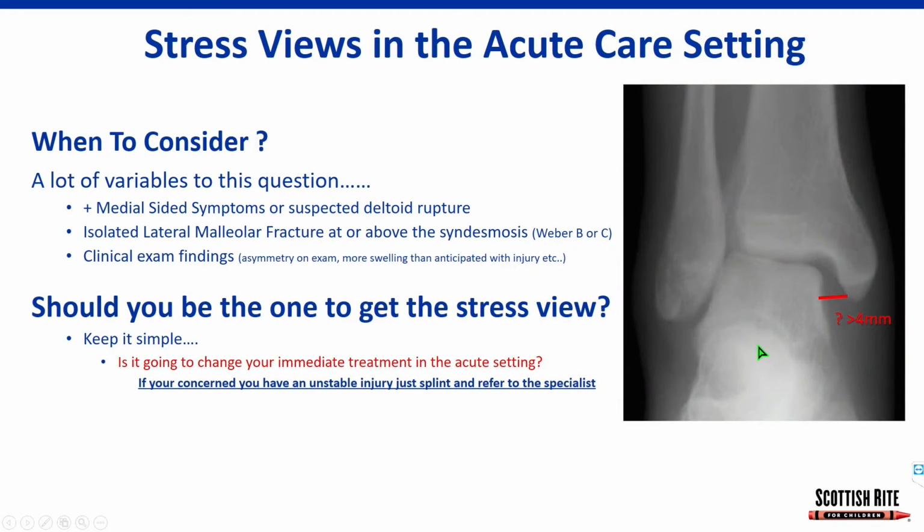Stress views, when do we get them? Why do we get them? Well, again, that's a very controversial thing. I think this varies provider to provider, and the first thing I'd ask you is, depending on where you work, should the stress view be something that you are concerned about getting?